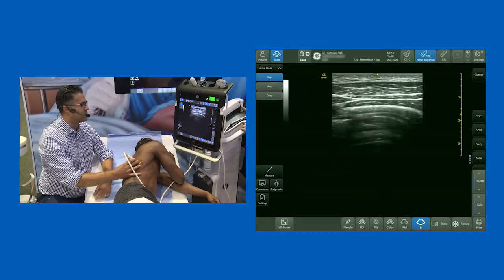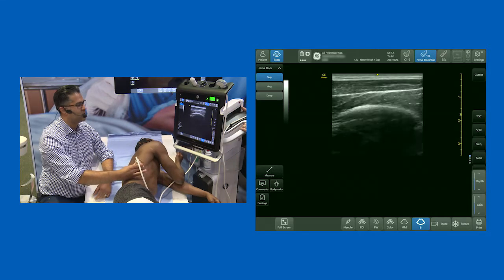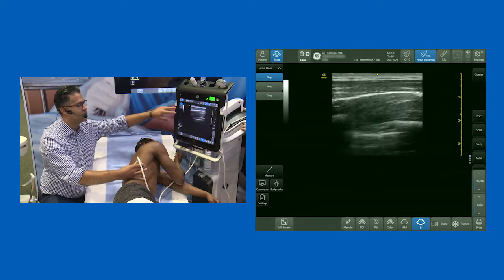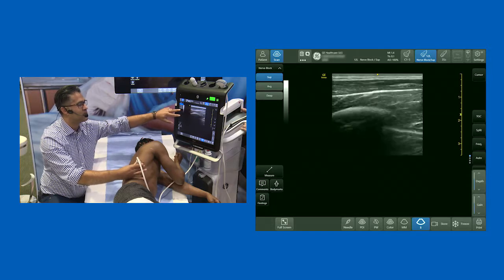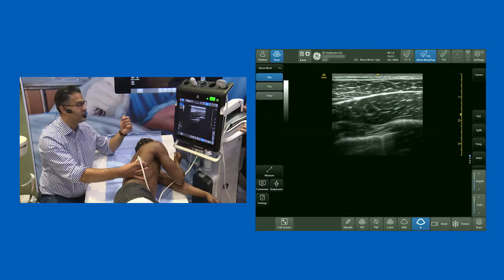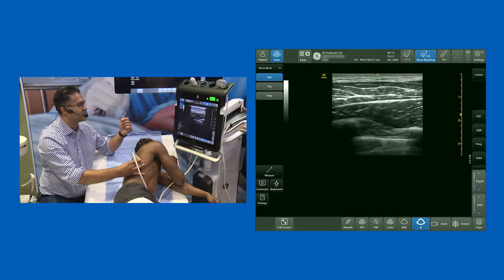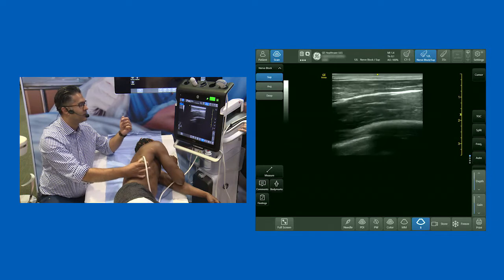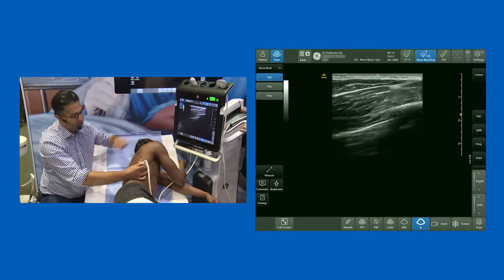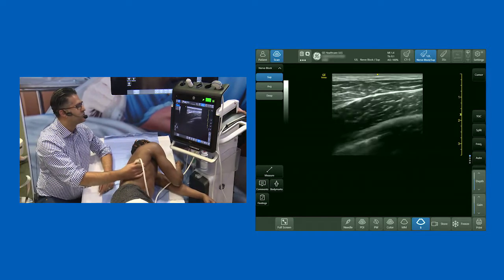As I slide posteriorly, I want to show off two muscle layers here — you can see how the fibers of the muscle are going in different directions. The superficial muscle is latissimus dorsi. As I slide back it becomes nice and thick, and as I go anterior that muscle fades down to a nice sliver. This correlates with where you see latissimus dorsi ending, so you can correlate your ultrasound anatomy with real anatomy, which is often not the way.